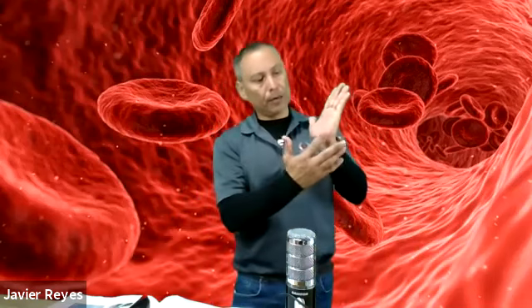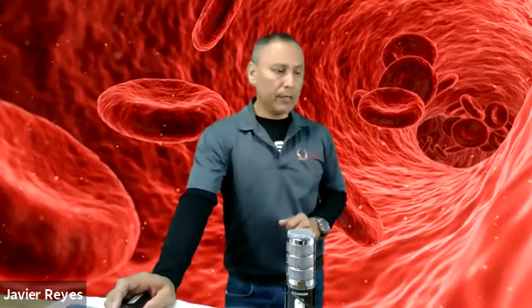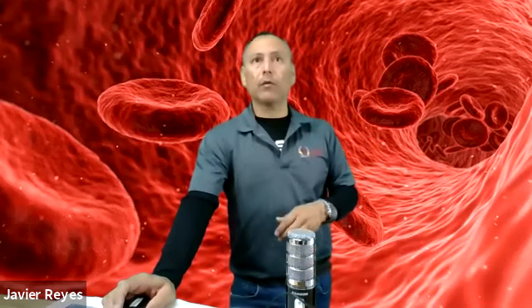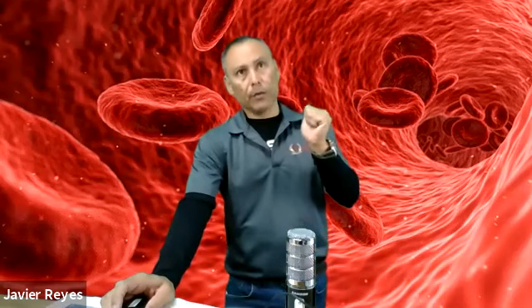Same thing in the infant heel. You're going to be on the sides. Again, make sure you warm the site. Warming the site helps tremendously to increase blood flow. When you're performing the puncture, you squeeze and release.